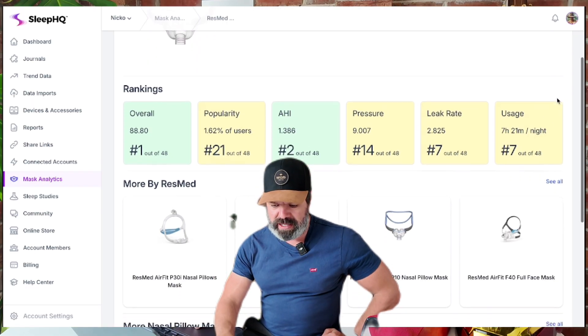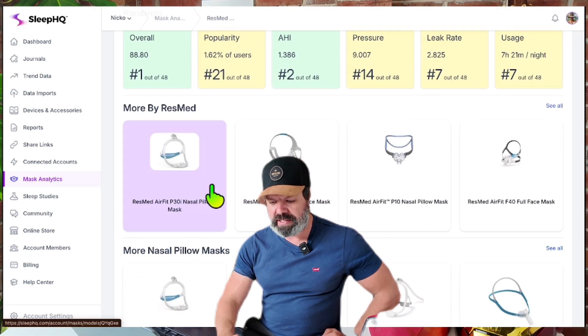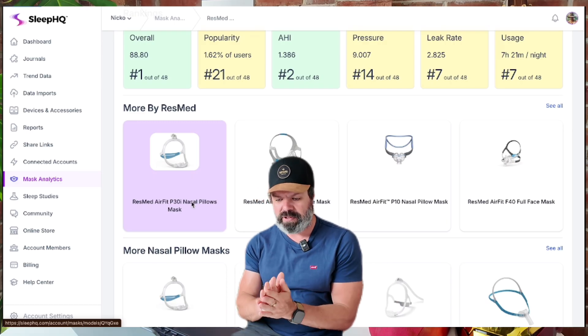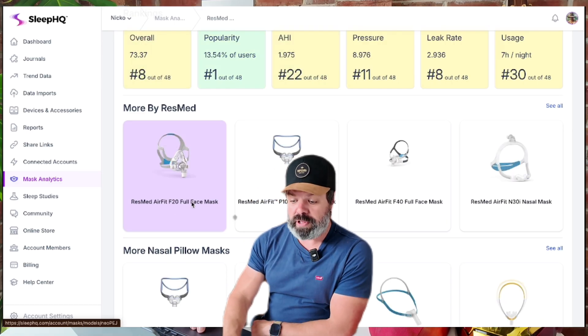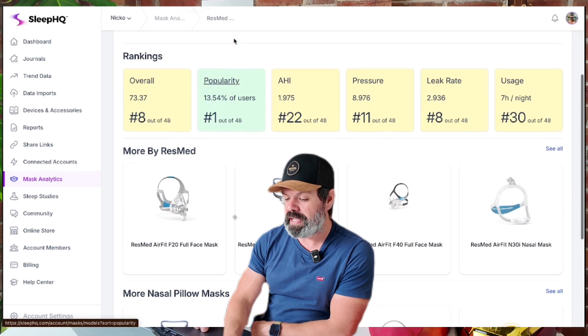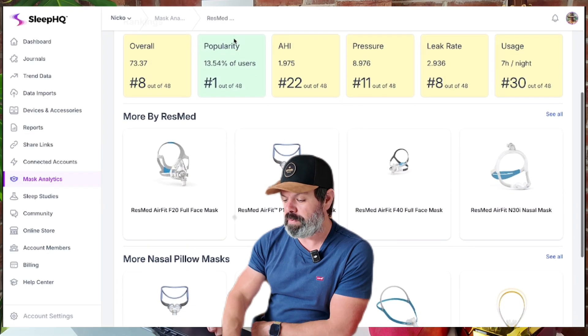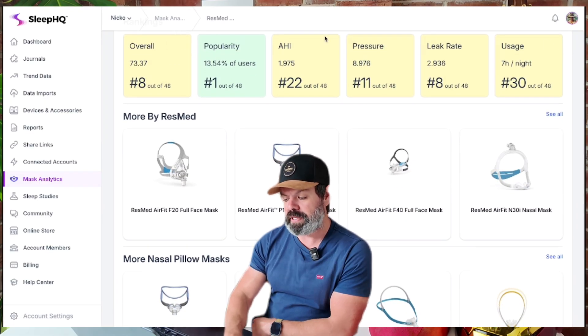And we've got some more masks here by ResMed. We can jump in to the P30i and have a look at how that's doing — the most popular mask on the Sleep HQ database. Here are all the different metrics and how it's performing.